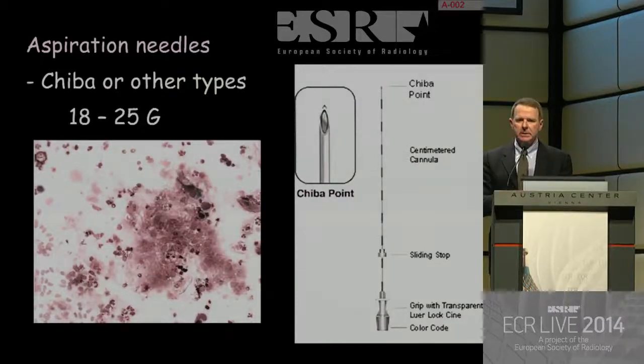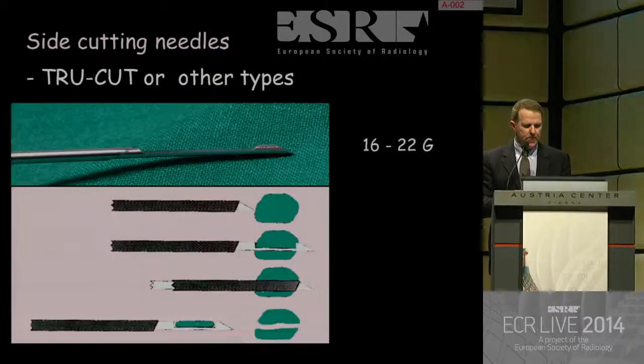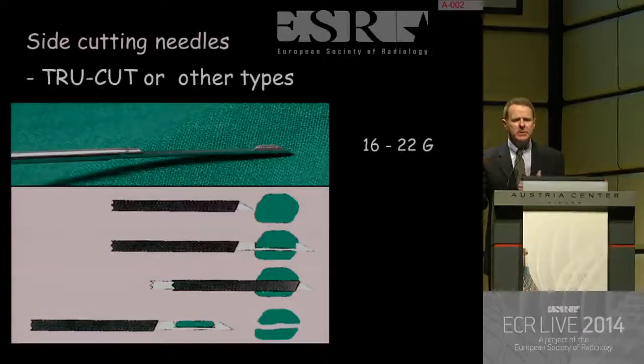So you can get cytology. But as we say, most of the time in these patients, if they are not operable and they will not have a definitive histology, you will never get a definitive histology. You need to go for histology with your own needle, okay? And wait for the phone call of the pathologist saying, look, I have good material. So you have to decide what kind of cutting needle you're going to use.